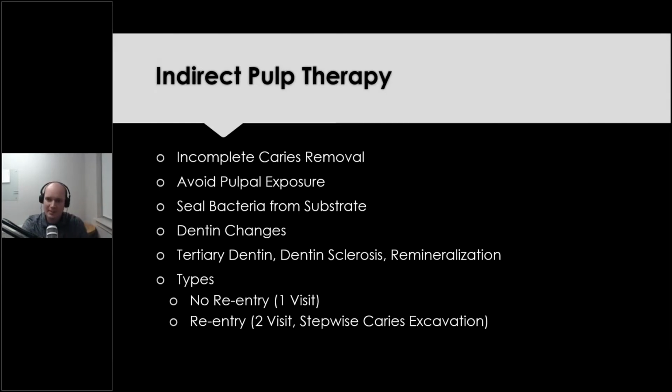This is what I'm excited about as well, indirect pulp cap technique. This can be used with the SMART technique with the Riva Star, and you can have a very aesthetic outcome. But it's going to be incomplete caries removal. We're going to leave decay and avoid the pulp exposure. You can place Riva Star and then go ahead and place a glass ionomer and then also composite over that if you'd like, or restore it with RMGI as well, or an alloy.